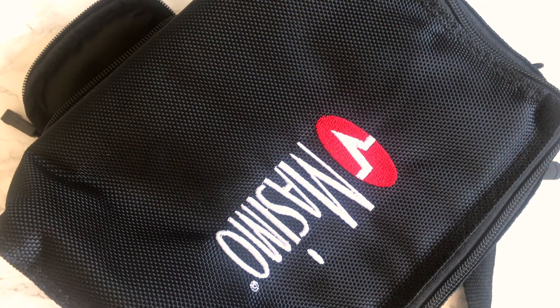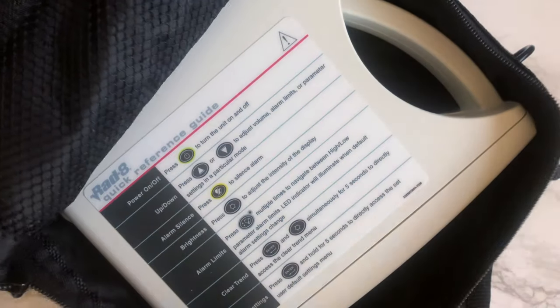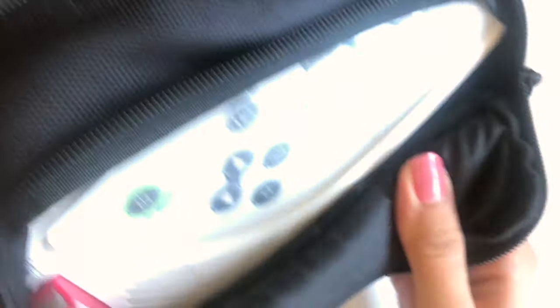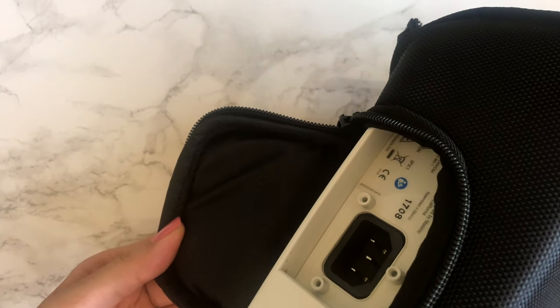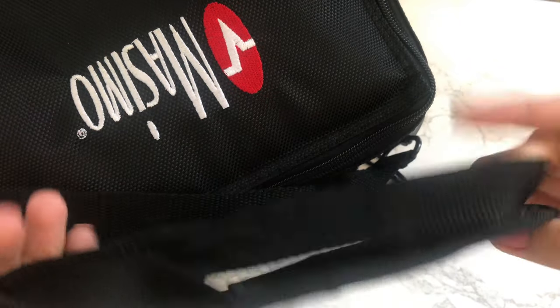The Masimo company Pulse Ox machine comes in a travel bag to easily carry it. It has an inner zippered pocket to store additional probes. The interface is fairly simple to use. It's pre-programmed by a doctor so you don't have to worry about the settings. The back part of the bag has an opening for the charging port. The shoulder strap allows for easy travel and is also removable when not needed.